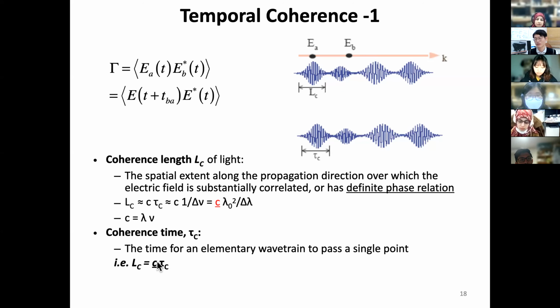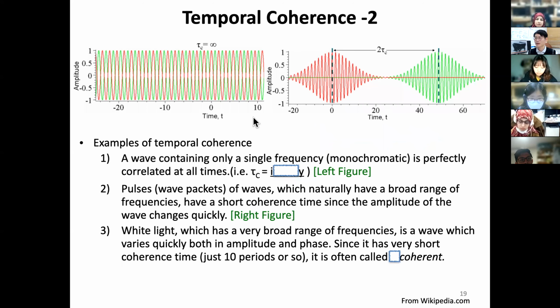This is the most important thing you have to understand. Okay, so let me go back again. Like a laser has infinity. So this is a laser at two different time points. You can see a nice interference pattern.